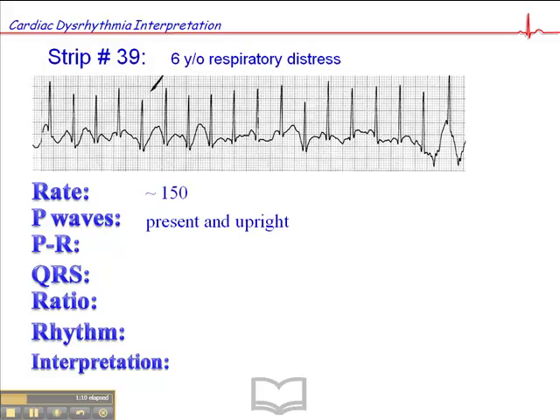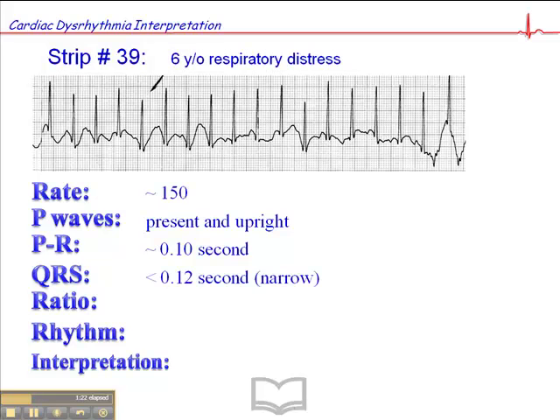This child also had a fever, and a high heart rate is consistent with a fever. The heart rate will vary when it's a sinus tachycardia. The P-waves are present and upright, although it's a little difficult to discern here at times. The PR interval is about 0.10 seconds, and the QRS is narrow. The ratio is 1 to 1.